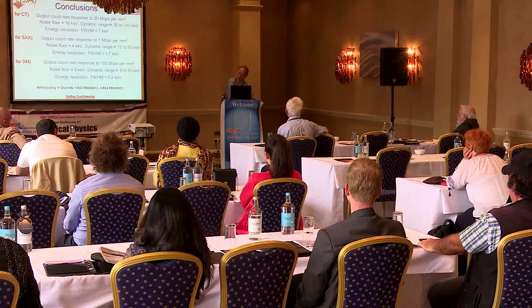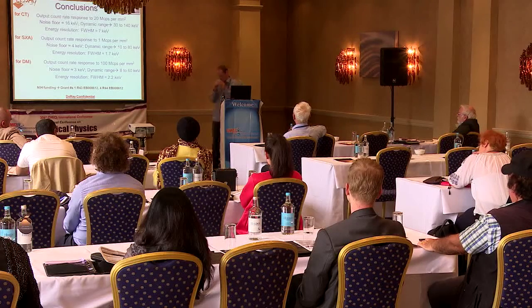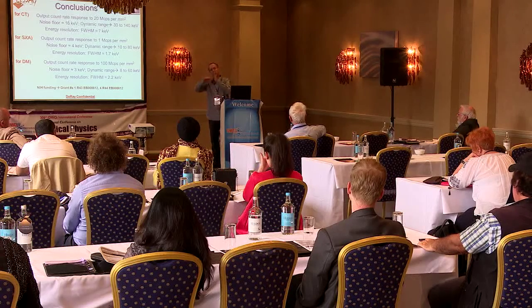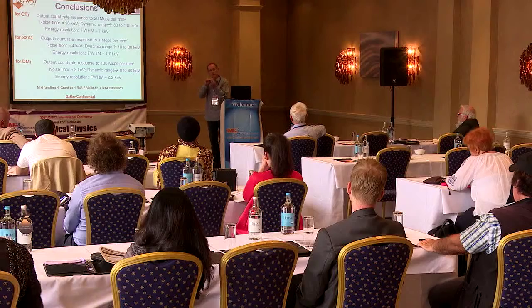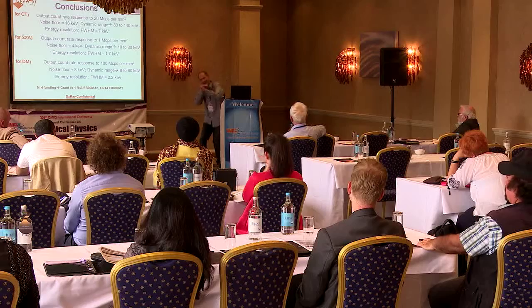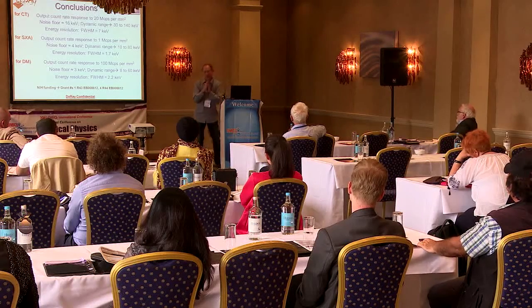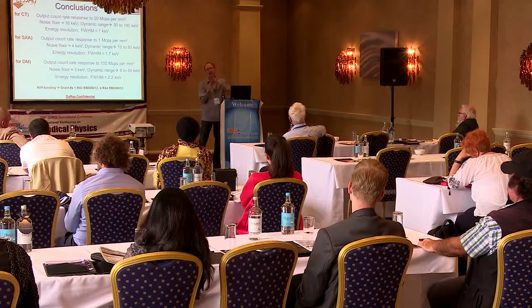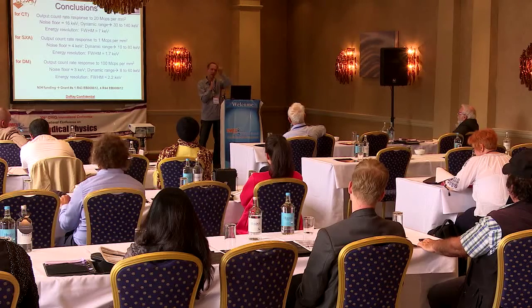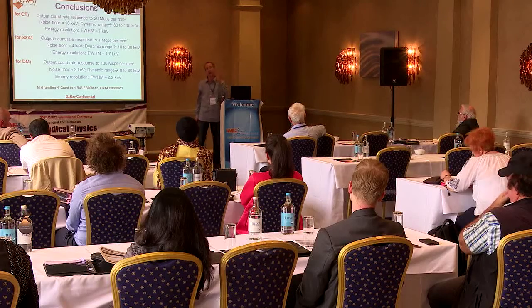That's a very good question. Inside the circuitry, after the pulse goes up over and triggers the threshold to count the X-ray, that threshold cannot reset until the pulse comes back down. So by decreasing the peaking time and the shaping time so that we use a near Gaussian pulse, then we can reduce the dead time. But your point is very good.